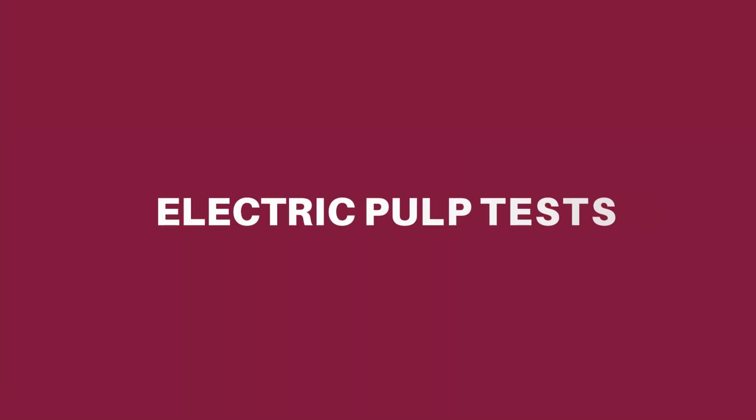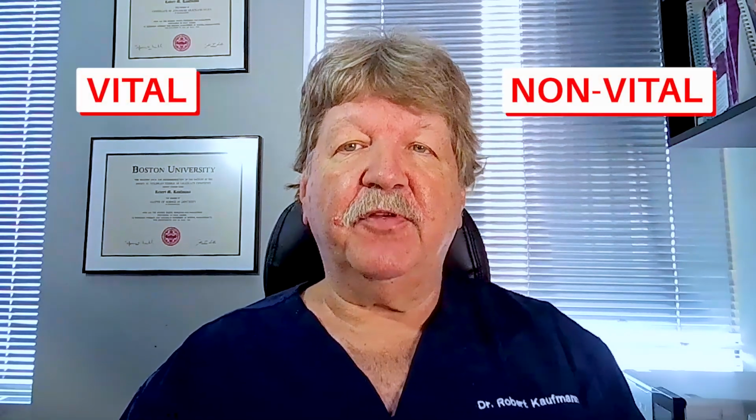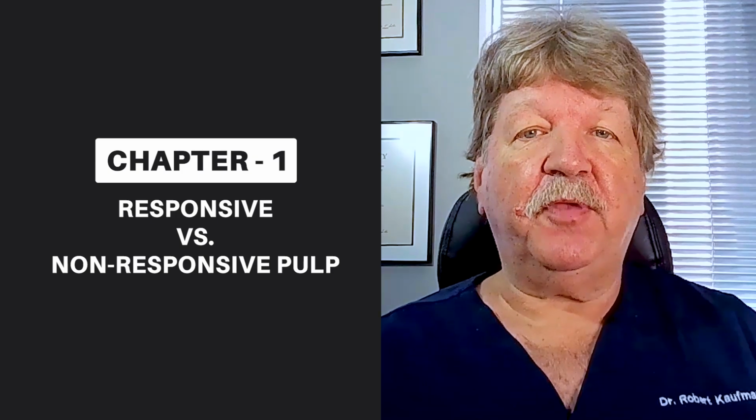Pulp tests are an important part of the diagnostic process. For many years, endodontists used to use the terms vital and non-vital for the condition of the pulp as tested with pulp tests. Many of us still use them today. The clinical assumption is derived from the responses to the pulp tests that we perform.